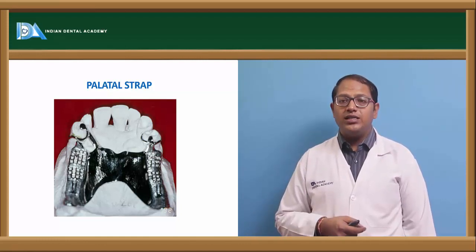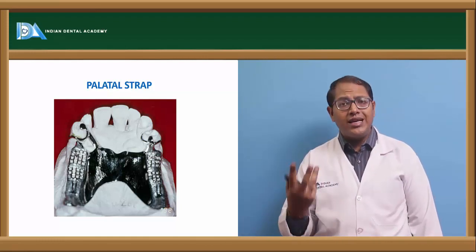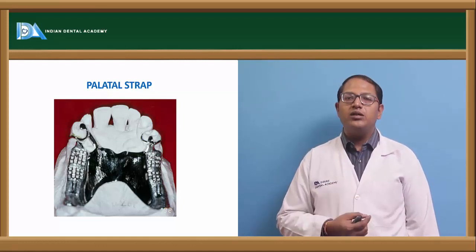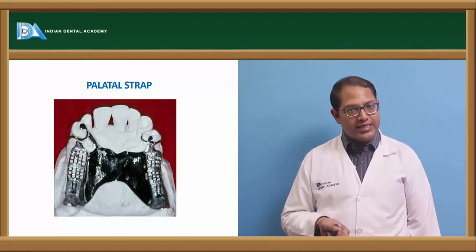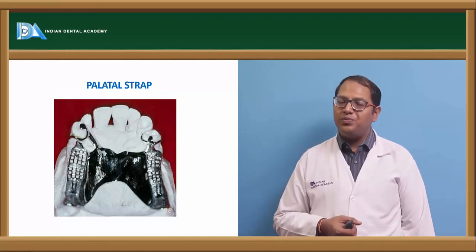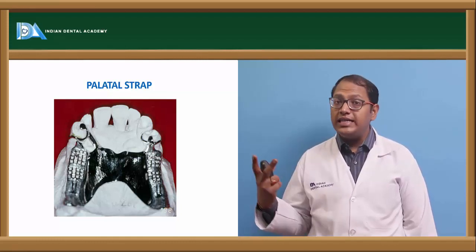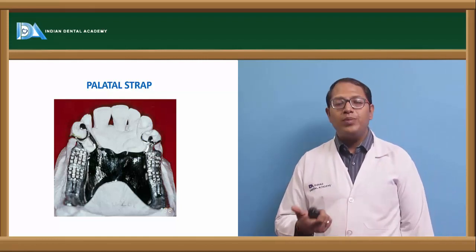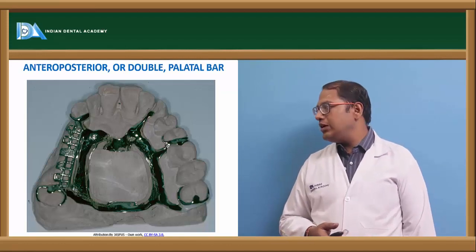The disadvantage is that the patient can have full palatal coverage, so sensitivity or taste sensations can be reduced in such cases. And the patient can also have a gag problem because we are covering the palate. Sometimes if it is overextended behind the posterior palatal seal area, it can cause gag to the patient as well. It also has an adverse effect on soft tissue. If it is very tightly adhered to the soft tissue, it can cause papillary hyperplasia.